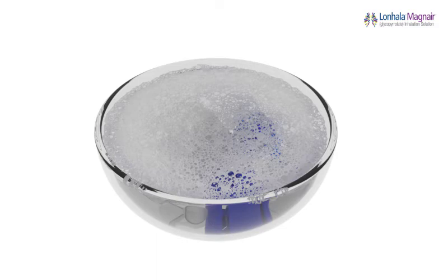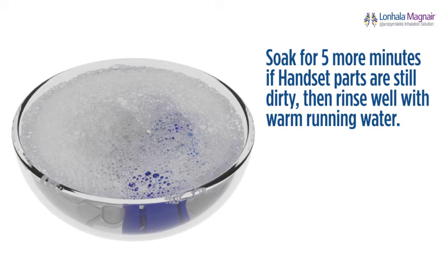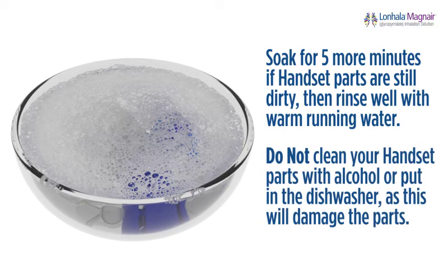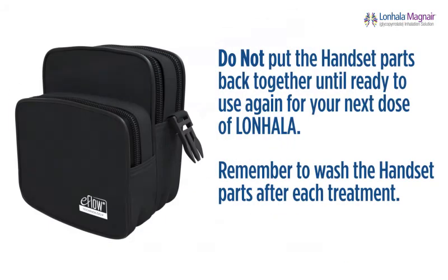Inspect all handset parts to make sure they are completely clean. If any handset parts are still dirty, soak them for 5 more minutes in warm soapy water, then rinse well with warm running water until all the parts are clean. Do not clean your handset parts with alcohol or put them in the dishwasher as this will damage the parts. Remove excess water by shaking all the handset parts. Place them on a dry, clean, lint-free towel and allow them to air dry. Do not dry the handset parts with a paper towel or touch the center of the aerosol head. After the handset parts are completely dry, store all parts in a dry, dust-free environment like the carrying bag provided in your starter kit. Do not put the handset parts back together until ready to use again for your next dose of LONHALA.